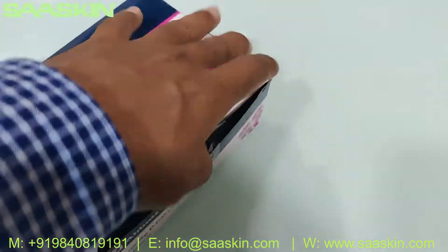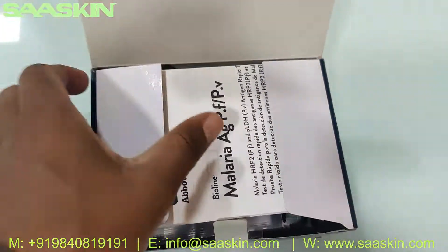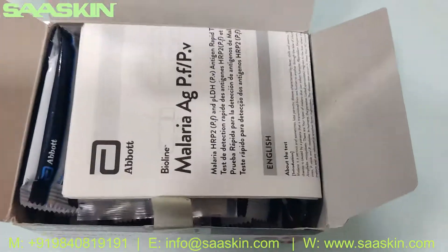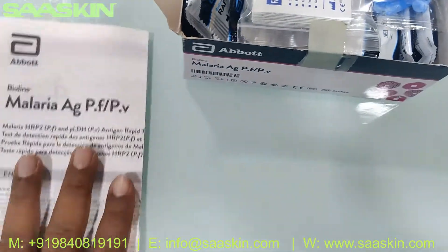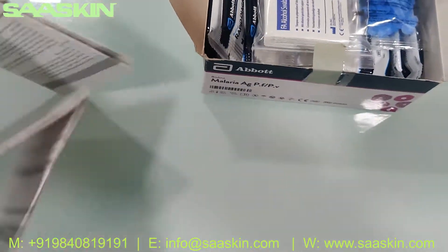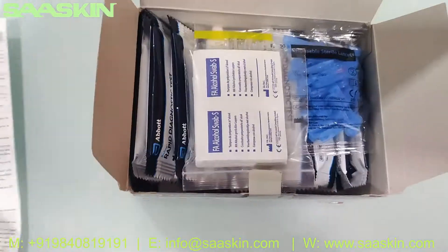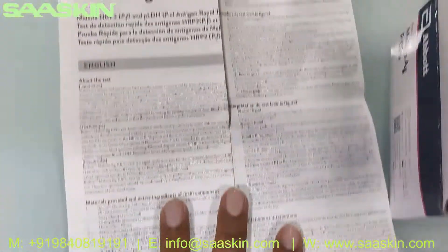Inside the box you have an IFU brochure. This is a very big IFU brochure — let me open it up so you can see it clearly.